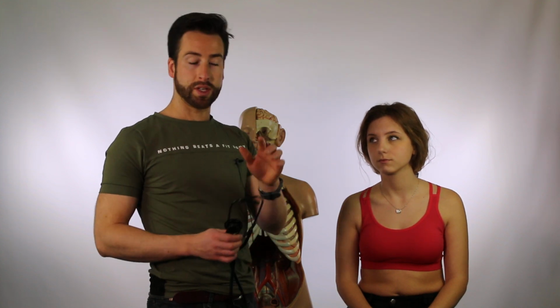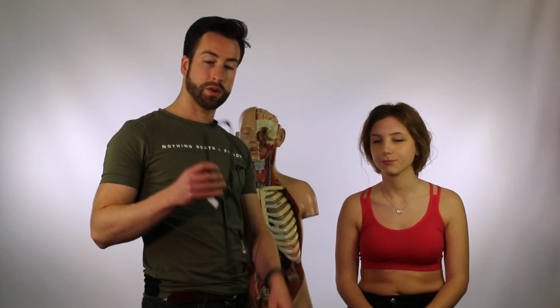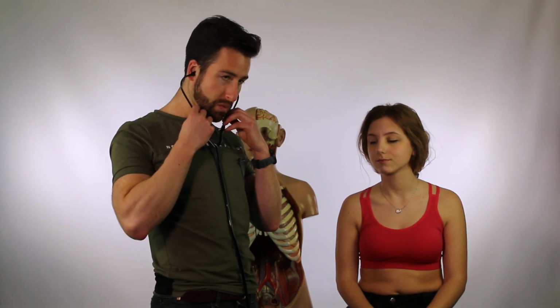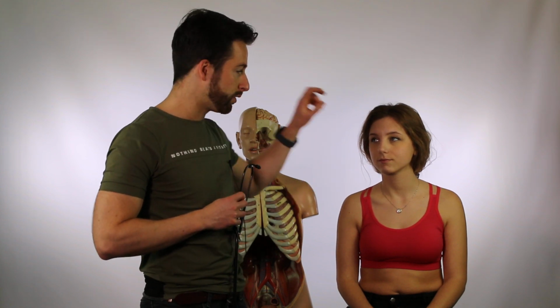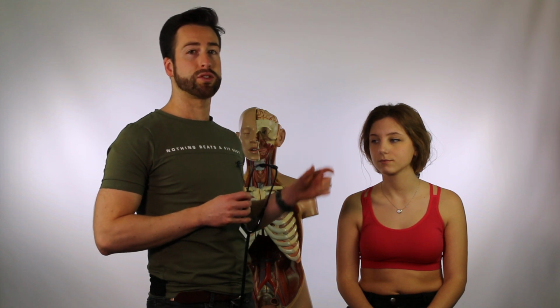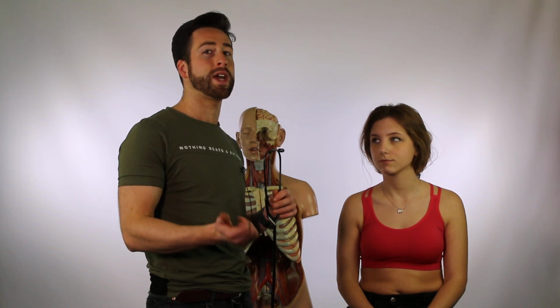I already mentioned the earbuds, so we're going to go and demonstrate. A little bit forward. Also, when we do one reference point, we continue and do the opposite side, and instruct the patient to breathe in and out with an open mouth. Each auscultation we listen to one exhalation and one inhalation. Okay.